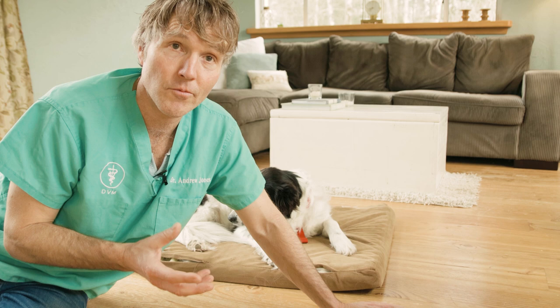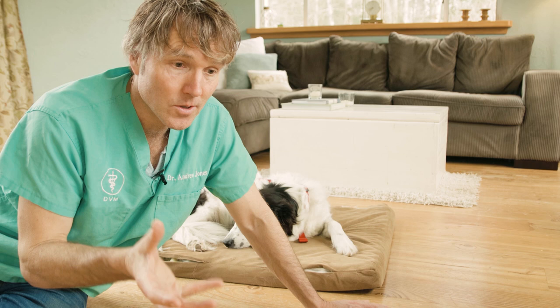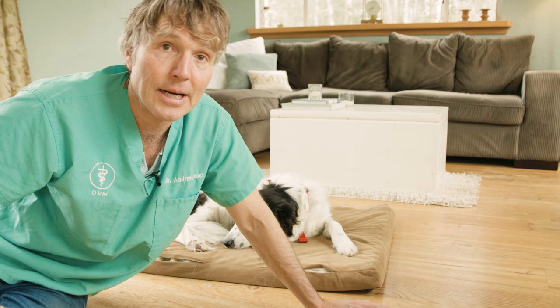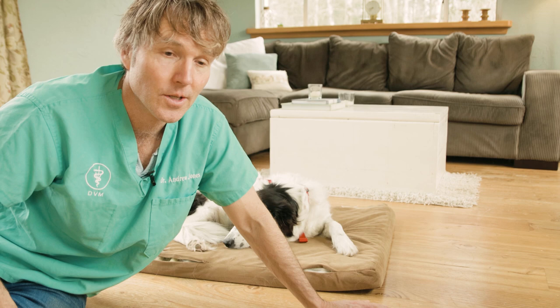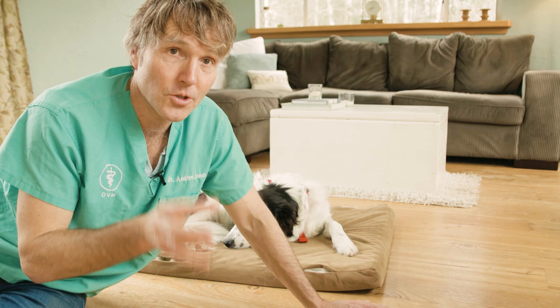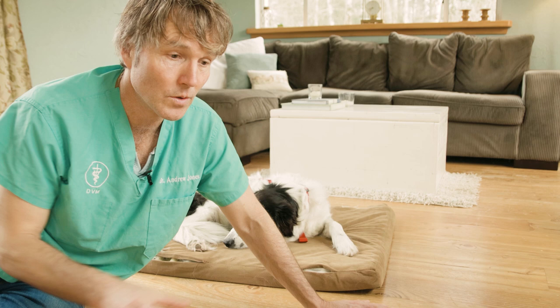Third, make sure they're not doing stop-start movements, not jumping up or down — not the things that injured the knee in the first place — because big forces on the knee can re-tear the scar tissue that is forming. Get the brace on in the morning and leave it on all day. If she's going outside for a walk, make sure she's on a leash — not chasing a ball or a squirrel. Be really diligent for the first eight weeks, as it takes about eight weeks to get the beginning of good scar tissue forming. You can't really evaluate that knee until about four months — about 16 weeks. It's only been about four weeks for Heather; we've got another three months before we can say we're out of the woods.